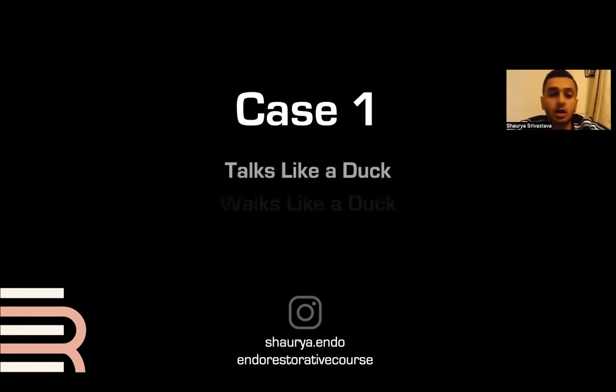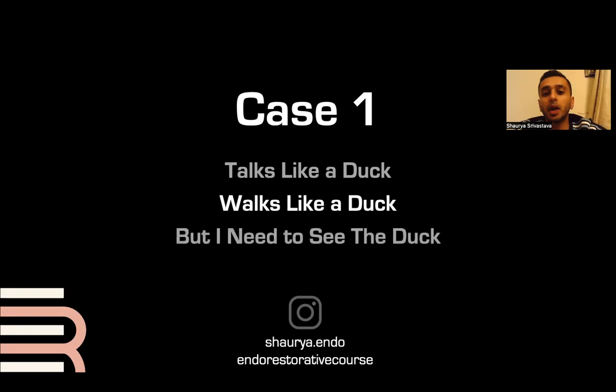So case one, we're going to dive right into the cases. We have about 12 or 13 cases to go through. We'll be talking through all of them. We'll answer all your questions towards the end of it. So case one: talks like a duck, walks like a duck, but I need to see the duck.